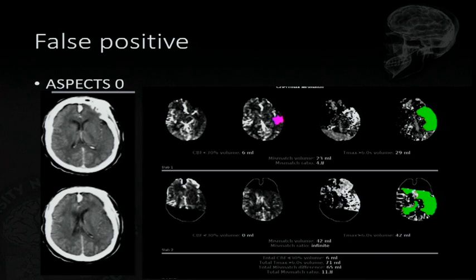Should you reacquire a slab if they've got a lot of movement? A lot of these patients are going to move because they're not following commands, so there's no point of reacquiring. And if it's a little movement, RAPID can handle that. But when they're moving a lot, you're not going to make them still. So we'll just go with each slab acquisition. It's 60 seconds for each one. So you'll hear that radiation going for 60 seconds for each of them.